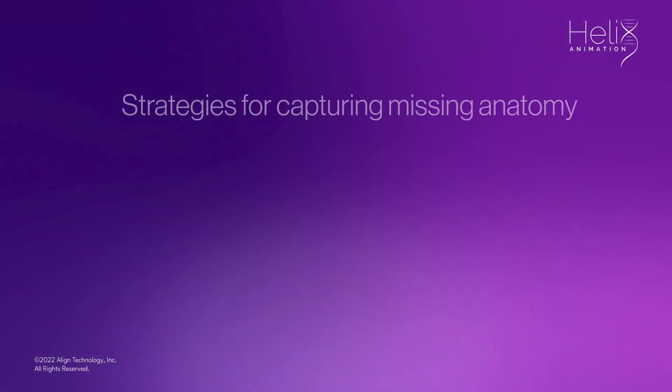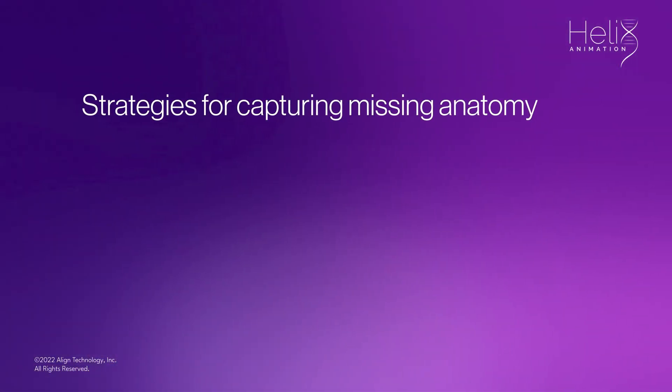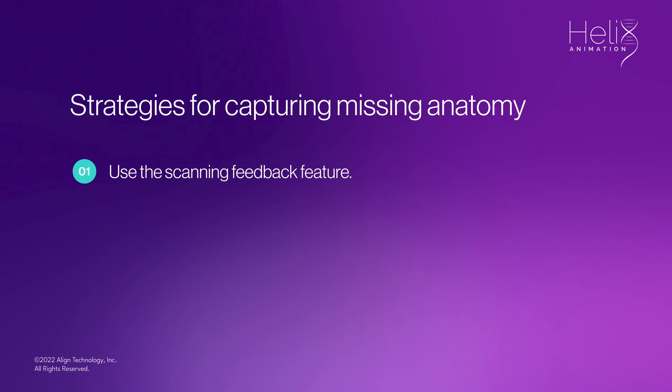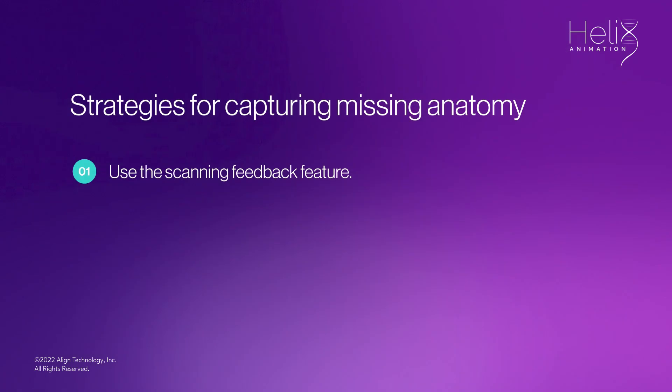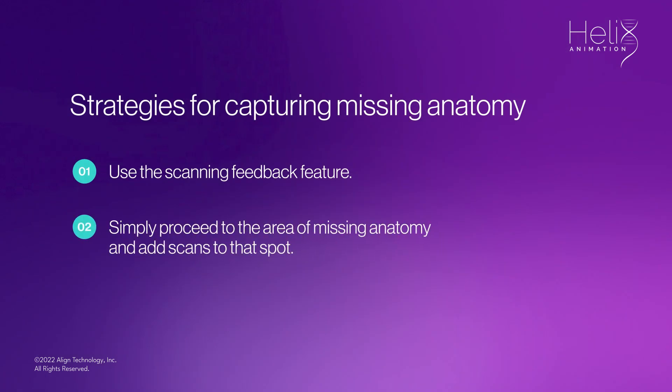There are two strategies for capturing missing anatomy. Use the scanning feedback feature which detects the holes and provides a color — red in monochrome and purple in color mode — indicating the area that needs to be filled in. The second option is to simply proceed to the area of missing anatomy and add scans to that spot.